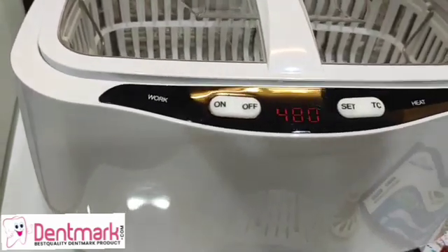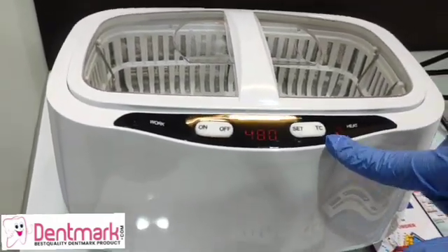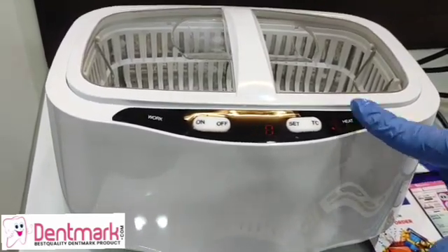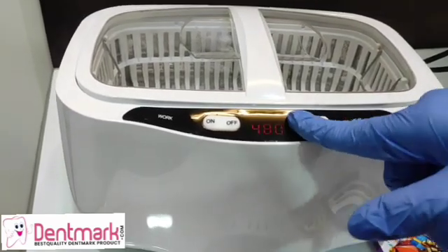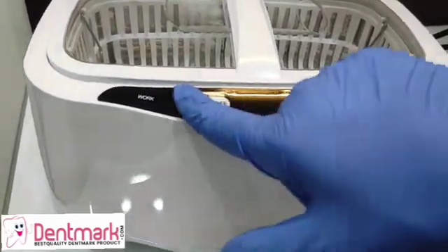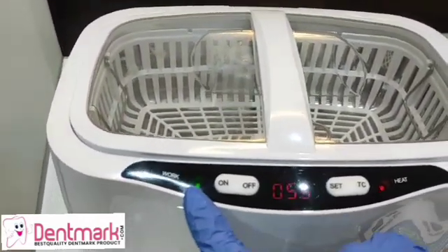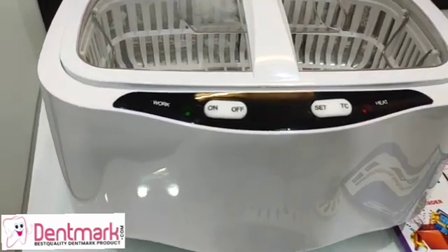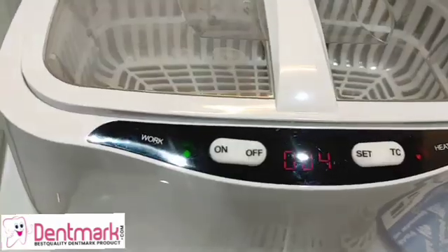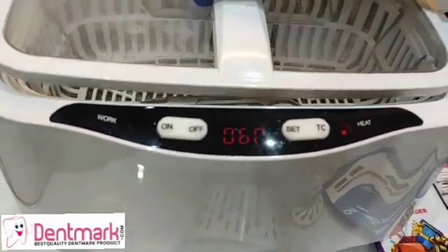This is the TC setting, which is related to temperature. When you put it on, you will see the heat sign come on. Let's fix the timer to 60 seconds — it's set now. Let's start it, and you can see it has started working. The green signal will tell you that your ultrasonic cleaner is working.